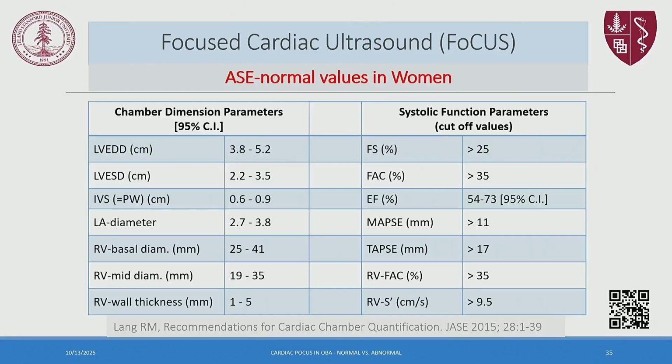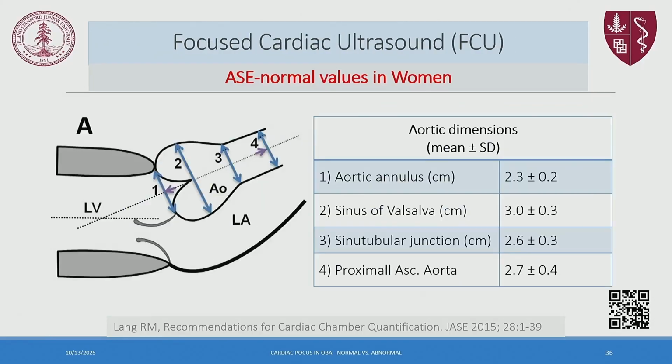If you want to take a photograph of this, because I looked up the normal values for pregnant patients, so for female patients of pregnancy-related age. I can also share this with you later. The same here, the normal dimensions for the aorta.